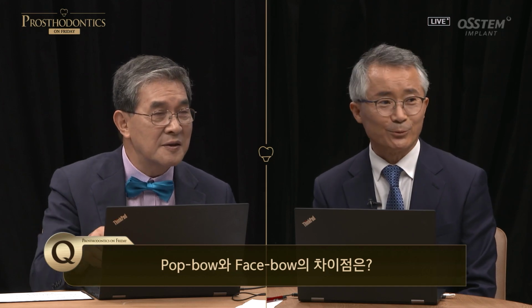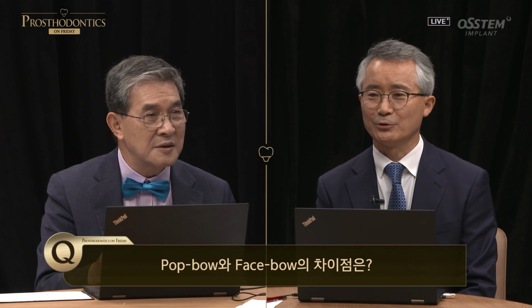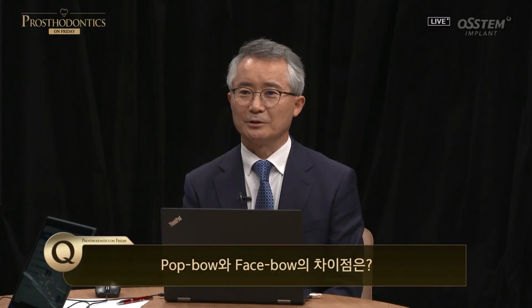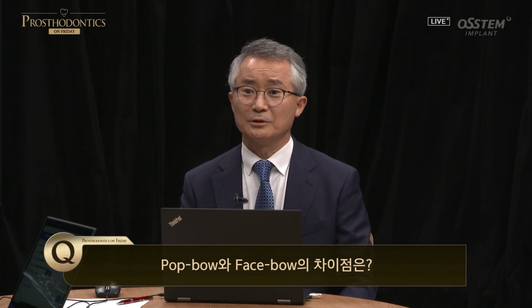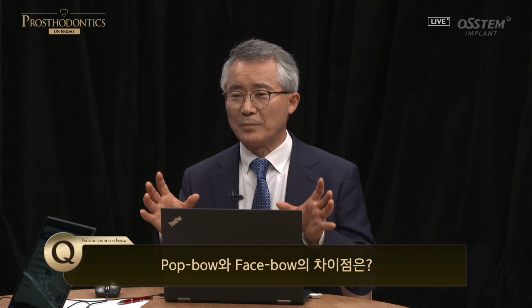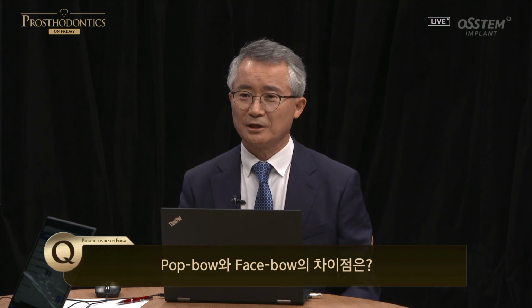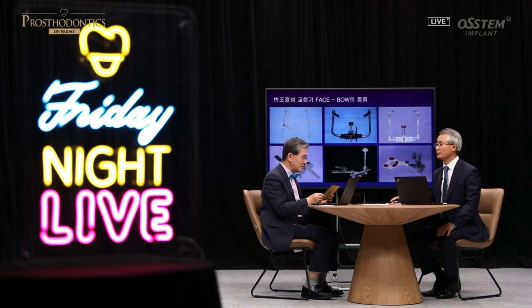I was not really aware of the pop bow, but a professor from Busan University came to Gyeongbuk University and Professor Kim So-young uses the pop bow. So I did see it and watch it in action. The pop bow is designed for people who do not have a face bow. If you do not have a face bow, then this can be meaningful, but as I've shown you earlier, even if you try to find the right plane and use a Fox plane, at times there can be deviations. Even when you use the pop bow, there can be error. This is expensive, but I think the face bow is much better. The face bow may have more functions than the pop bow. Thank you for your answer.